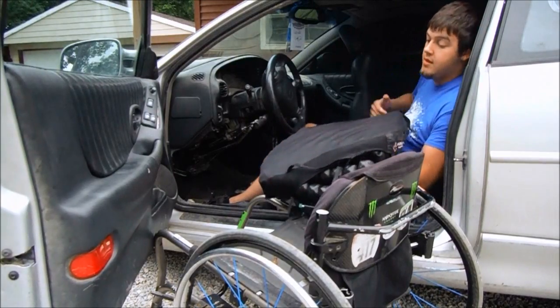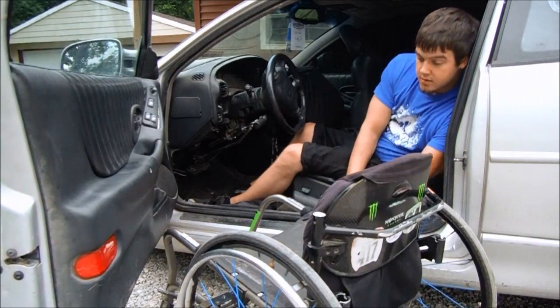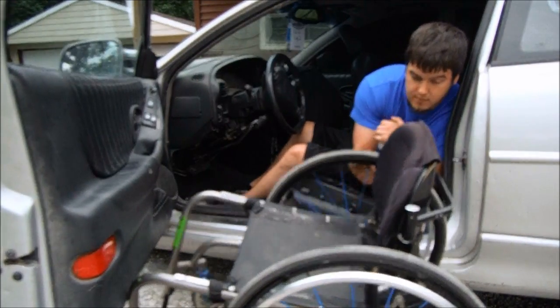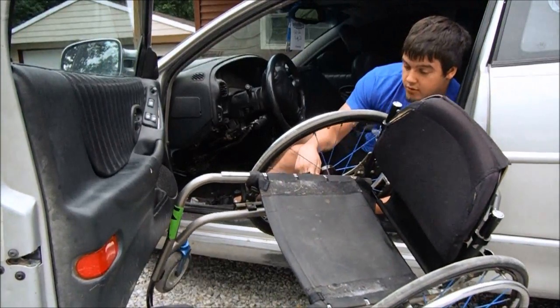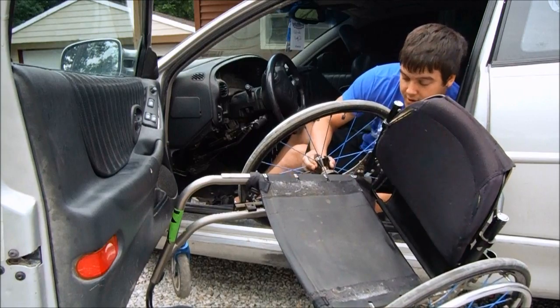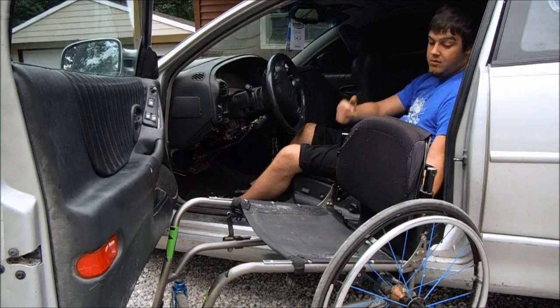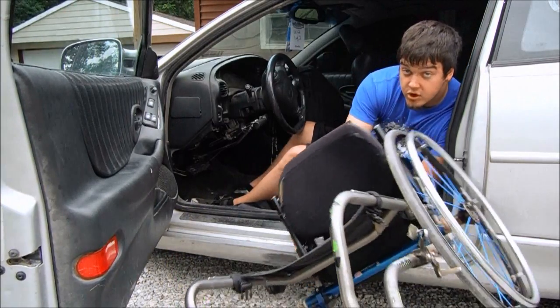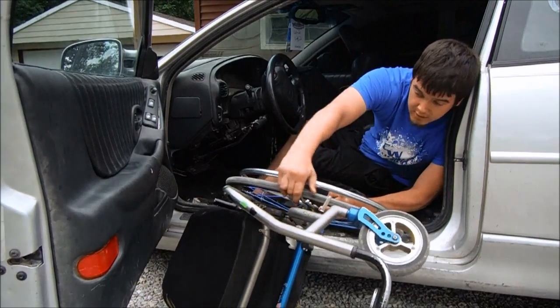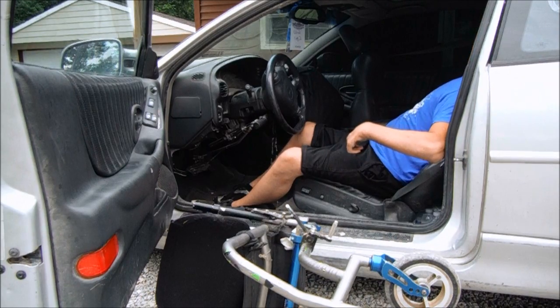I'll just pull the cushion and set it out of the way, unlock that brake, pull that up. These wheels have a little button right in the center — they just pop right off. I throw them behind me in the back seat, set them to the side, pull the chair over, same thing on that side, and unlock that brake.